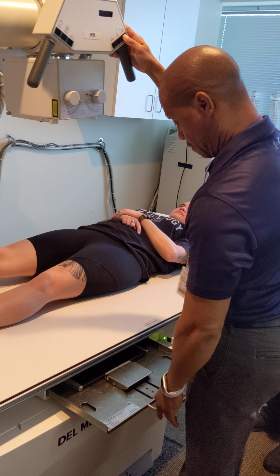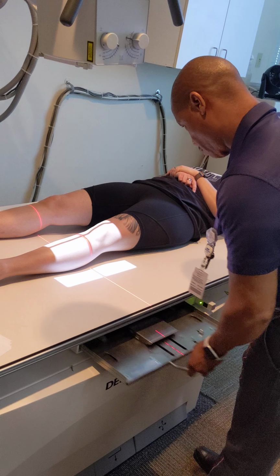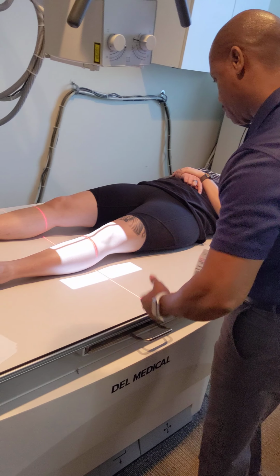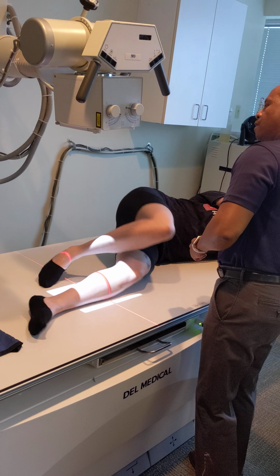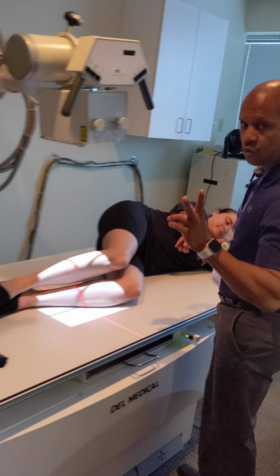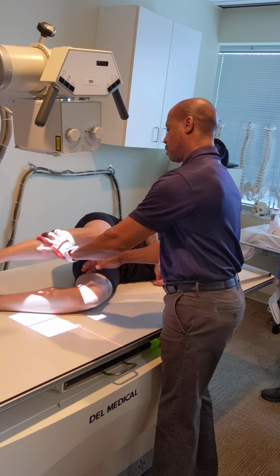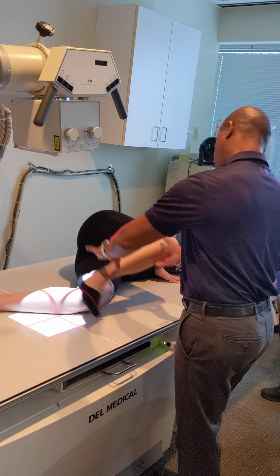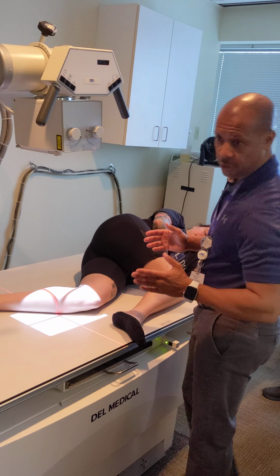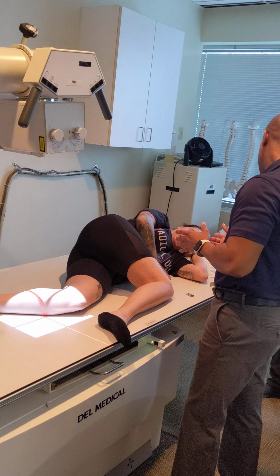Won't go any further. Slide back. All right, go ahead and lay on your left side, please, ma'am. Thank you very much. Okay, now we've got 1 or 2 options we can do with the leg. Option 1, we can have this leg up like that. Or option 2, bring that leg, cross it over. You need to do whichever one is going to feel best to your patient. Which one's best for you?